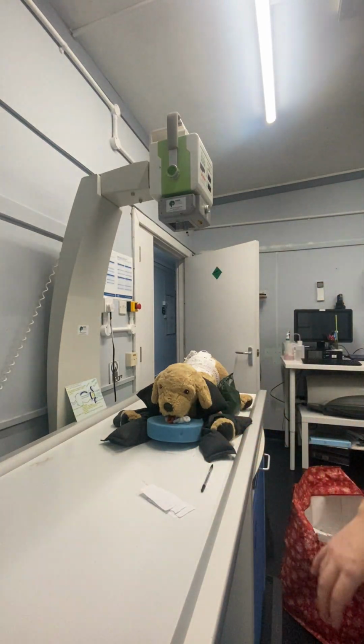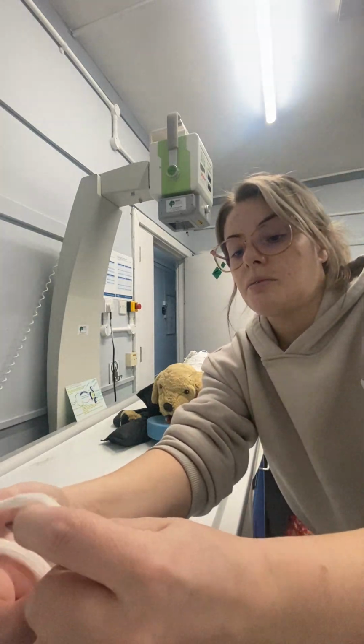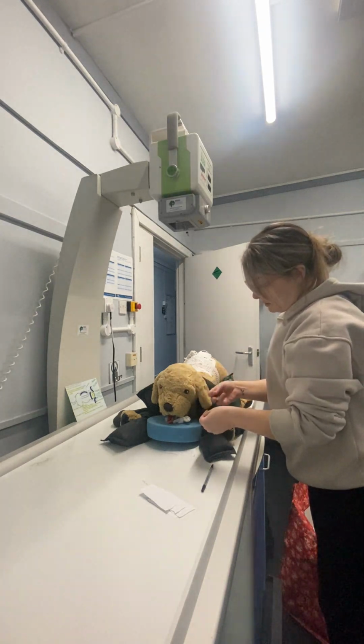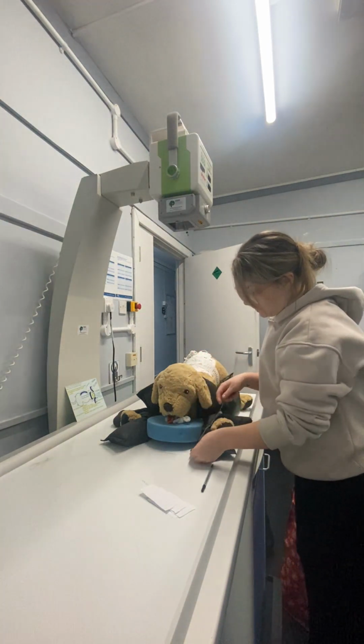And then I'm also going to use my right-left marker and place that inside the collimation as well. So this is the left side.